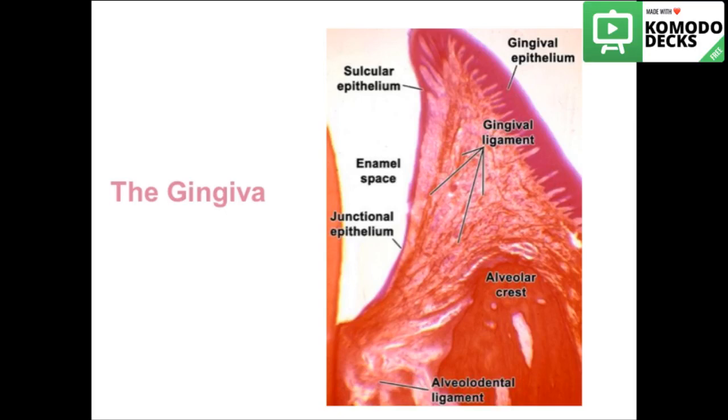So again, moving from the gingival margin, which is a thick keratinized mucosa, to the sulcular epithelium, which is non-keratinized, and the junctional epithelium, which is the most thin non-keratinized layer. So we move from keratinized to para-keratinized to completely non-keratinized tissue. We see in the submucosa gingival ligaments which bind the tooth and the gingiva.